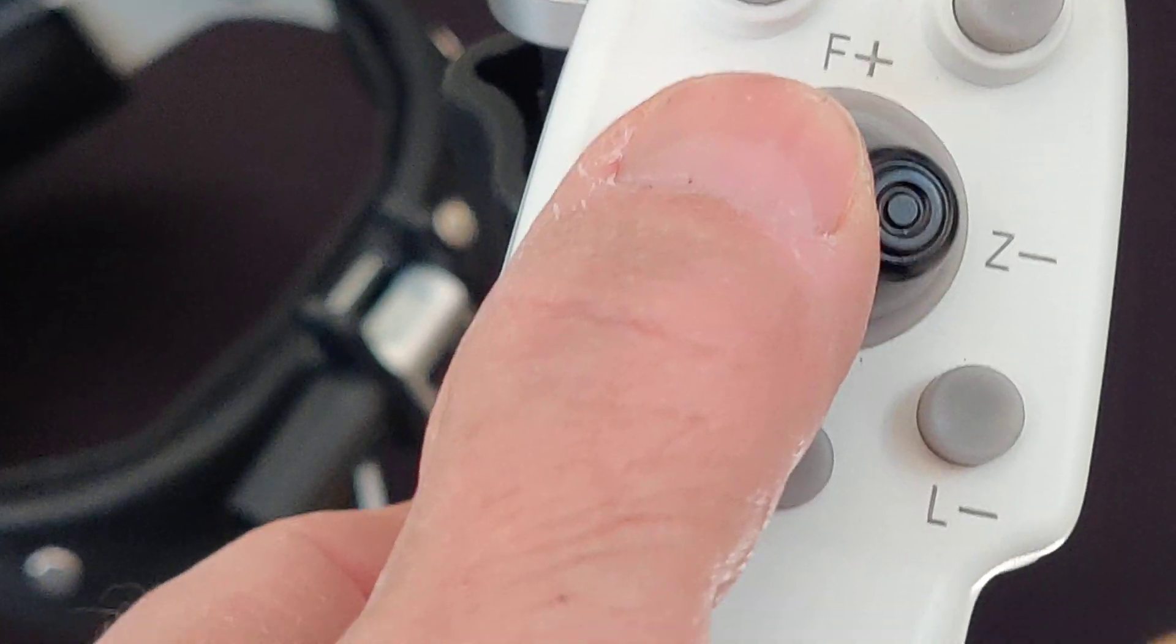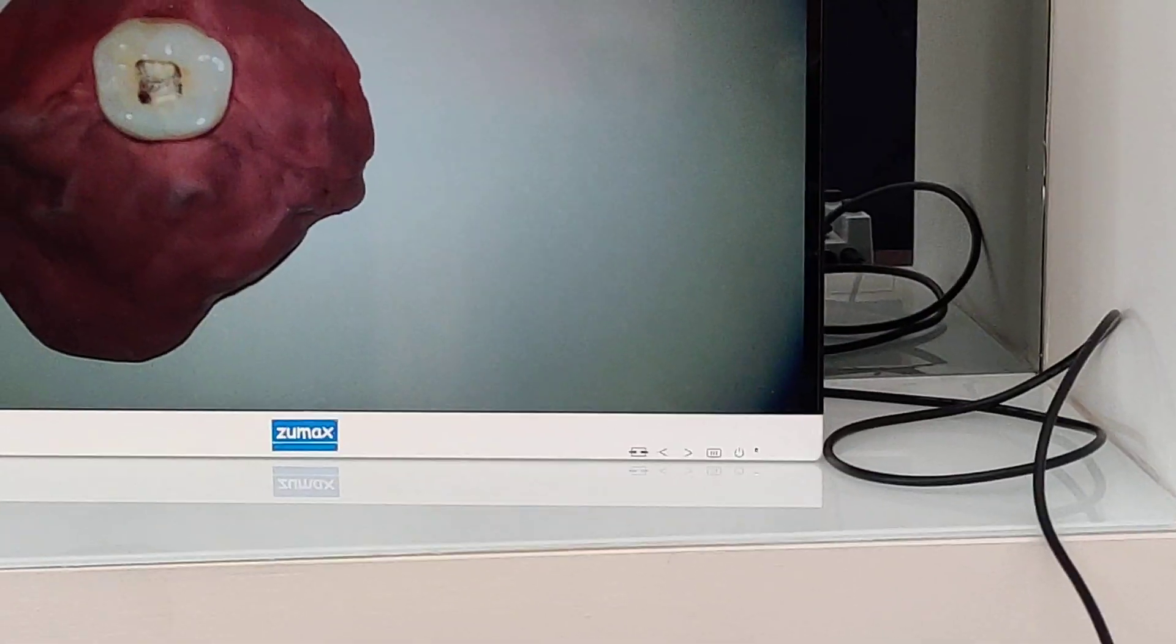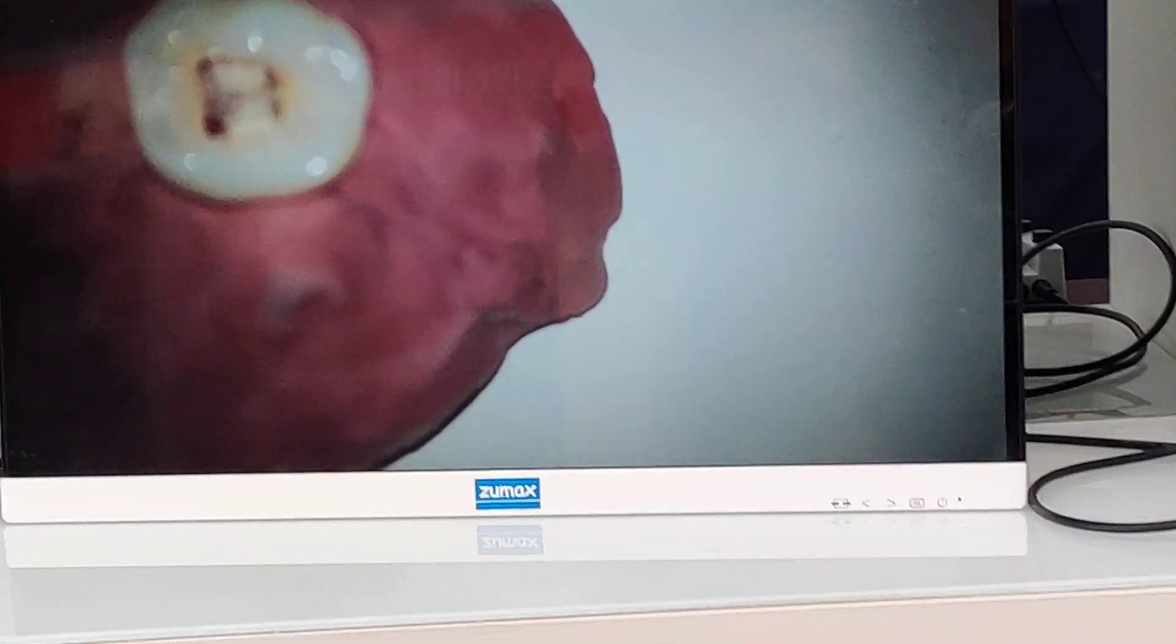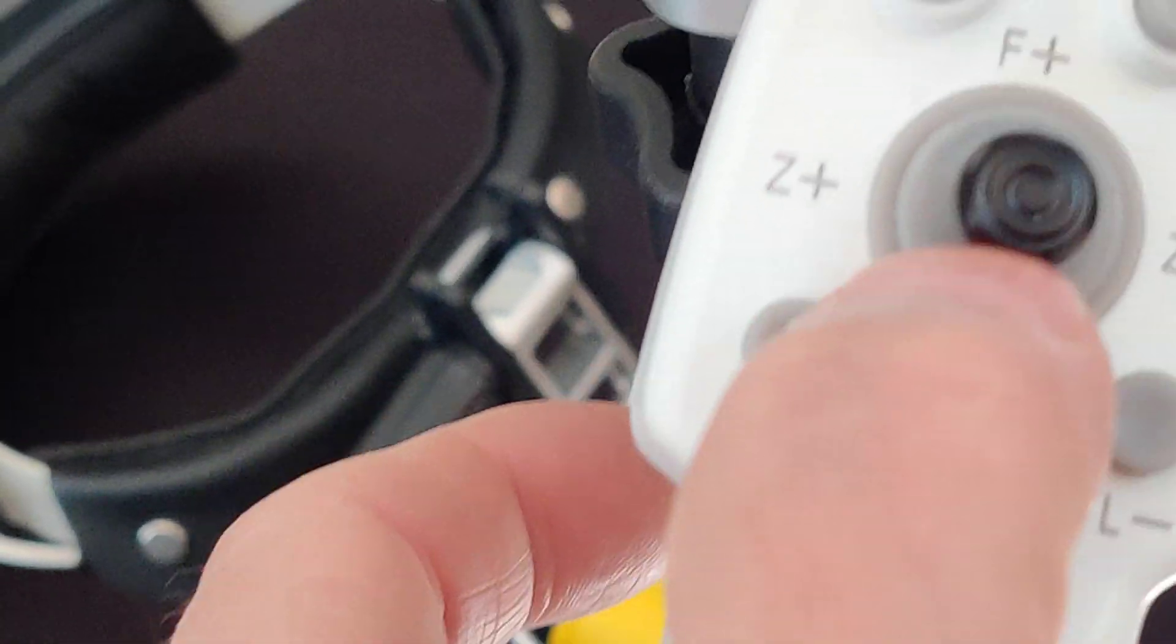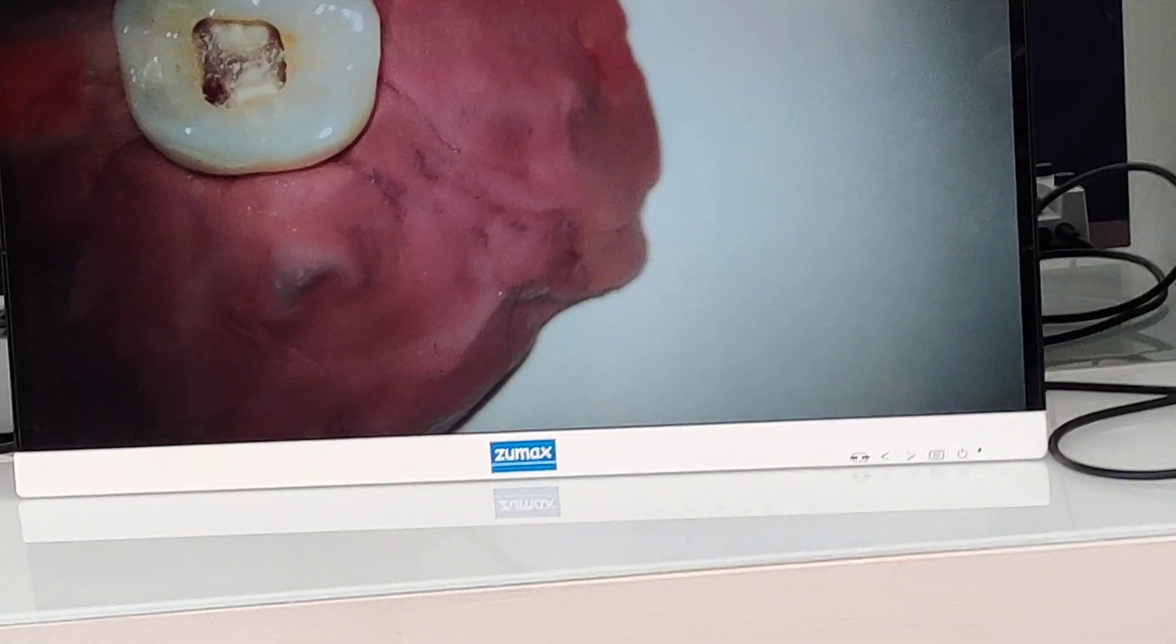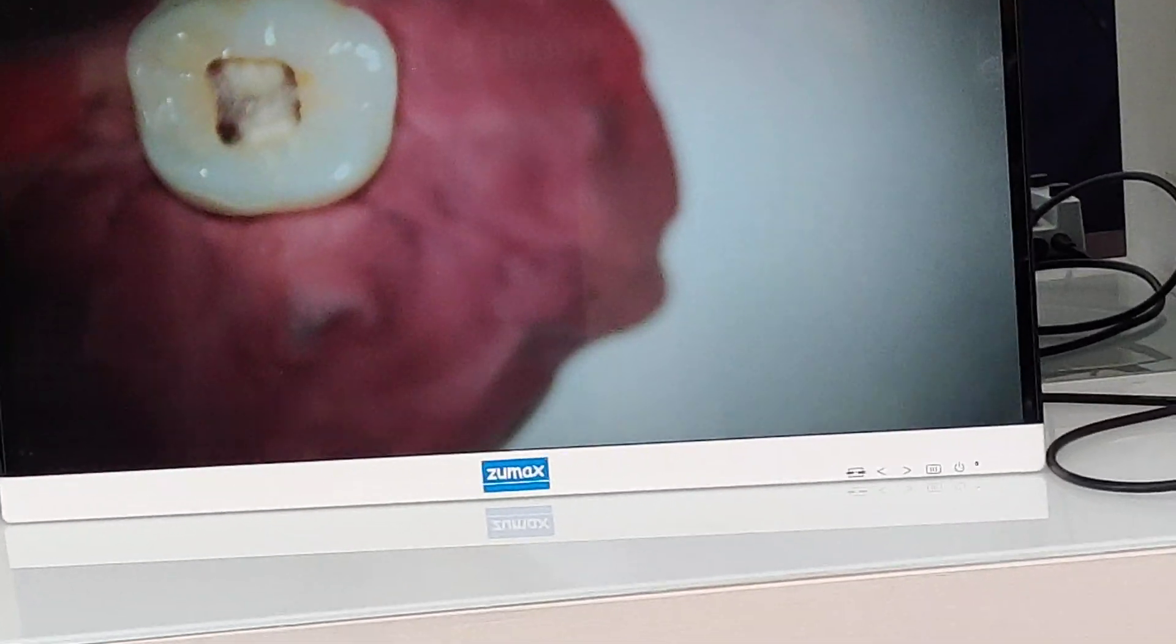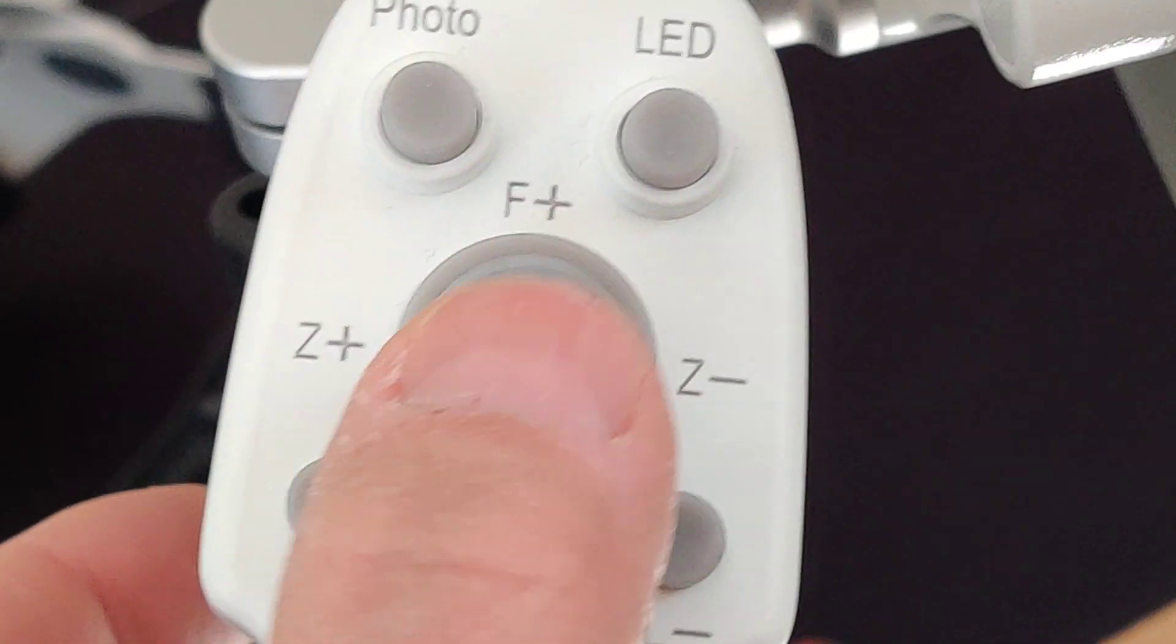Then what we have here, we have the magnification with the zoom. On the left side is getting smaller, on the right side is getting bigger. And here you have the focus. We have 250 millimeters focus range, going down and going up. So up and down the focus.